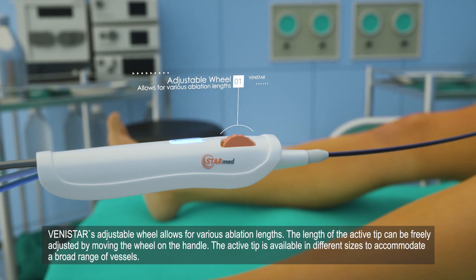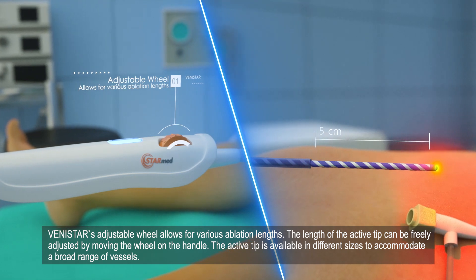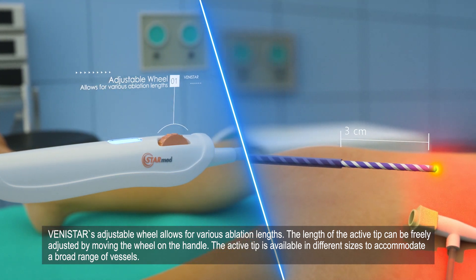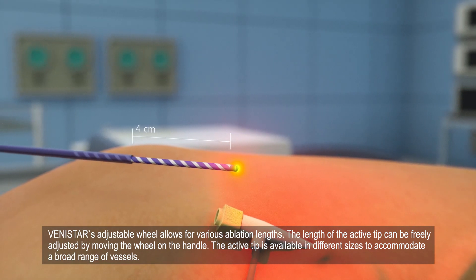Vinistar's adjustable wheel allows for various ablation lengths. The length of the active tip can be freely adjusted by moving the wheel on the handle. The active tip is available in different sizes to accommodate a broad range of vessels.